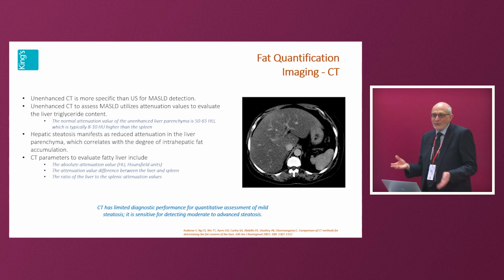So yes, it's a nice tool. You can see it's a fatty liver. The quantification methods for it are not accurate, and it doesn't detect low levels of steatosis. So yes, we've got that tool. We're not going to use it.